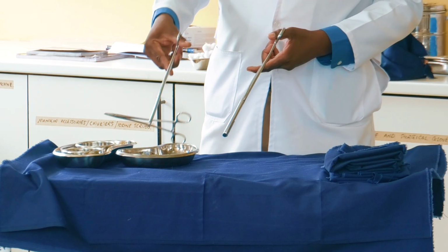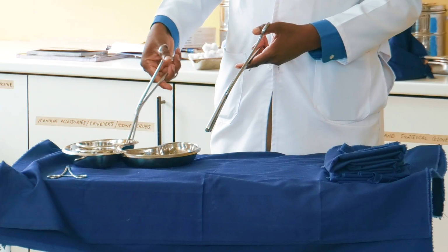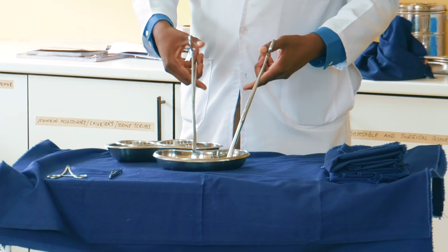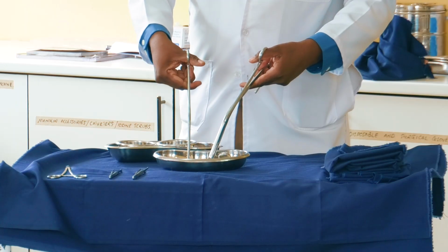So I'll put my needle holder, I think for the top shelf, it's one of the requirements. Your needle holder. Then you have your toothed dissecting forceps. Then you have your stitch scissors.